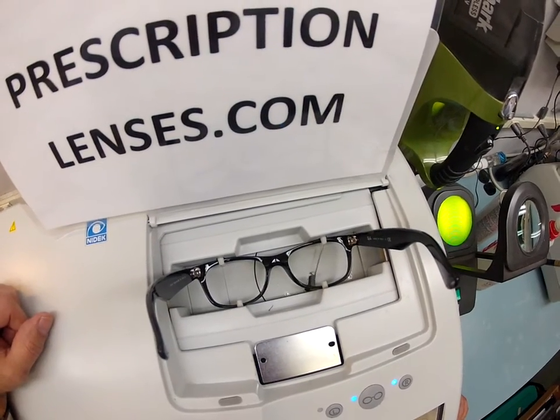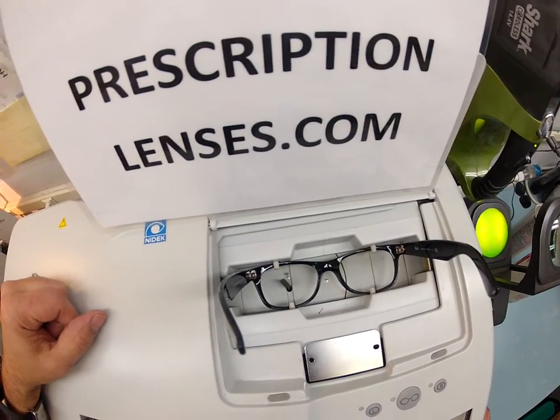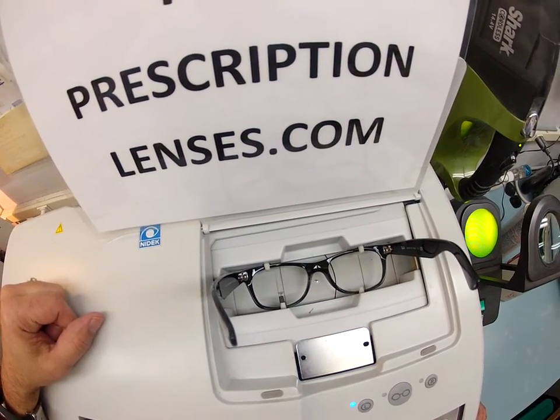It is now tracing the shape of your right lens. It is going to scoot over and trace the shape of your left lens. And then I'm going to pop everything up on the computer and start cutting.